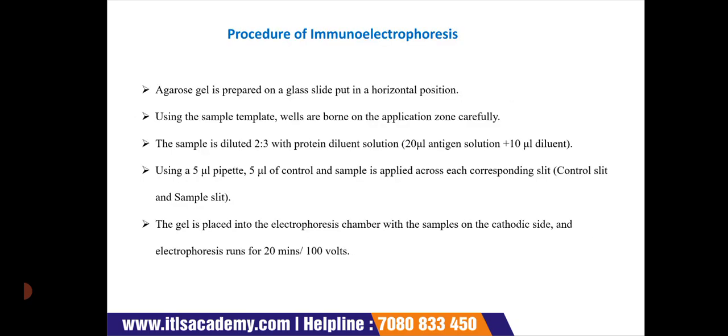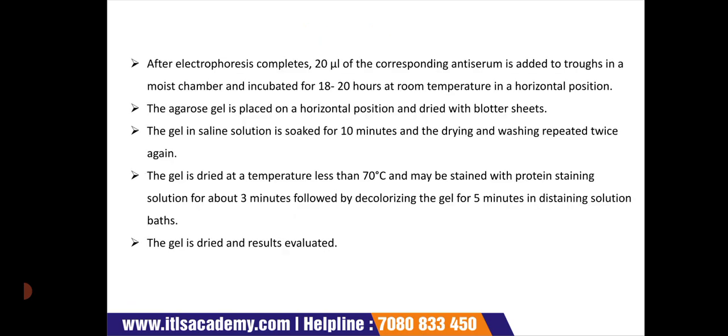Then the procedure we have discussed. You must know the incubation period, how many hours it takes for incubation.